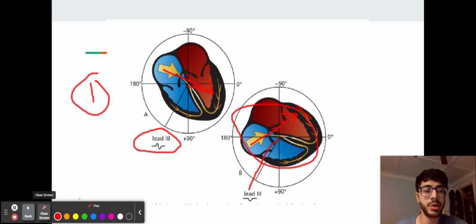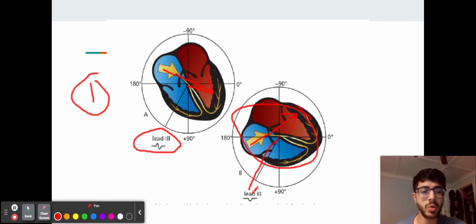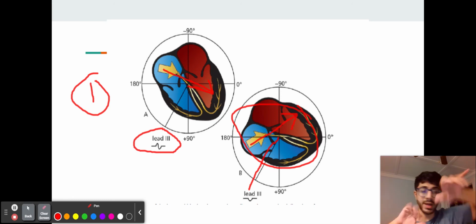So the only things you can take for granted are that the P wave will be negative in AVR and more positive in lead 2, those leads over there. Don't go looking for the biphasic P wave. You just need to know that as a concept that exists. Generally, you're not going to determine the axis by asking where it is biphasic and then reasoning that you're 90 degrees away from the mean axis. You're not going to do that.